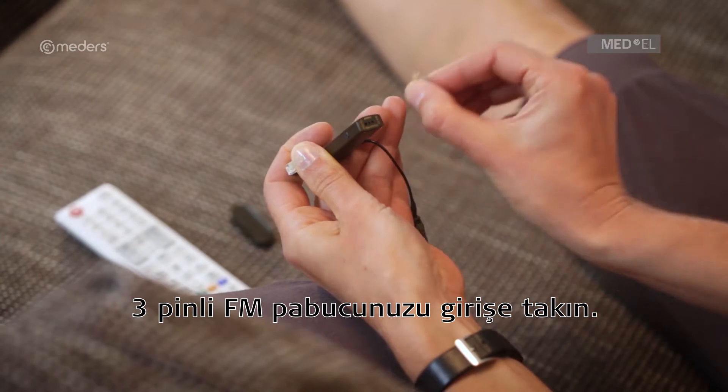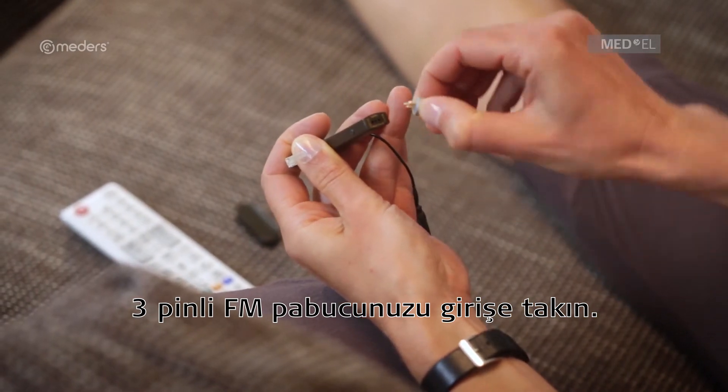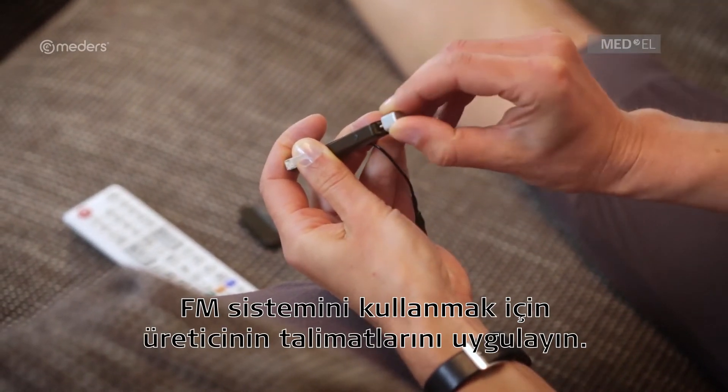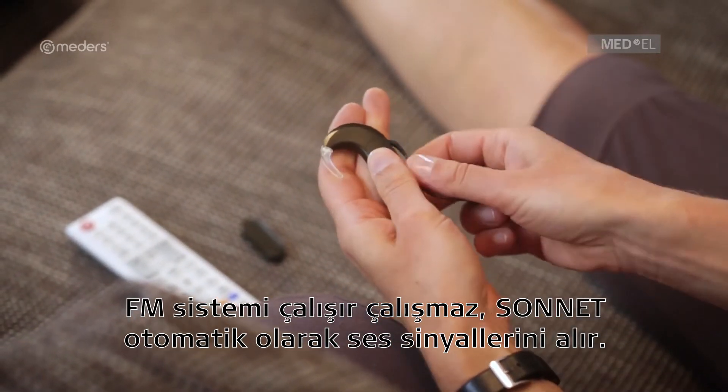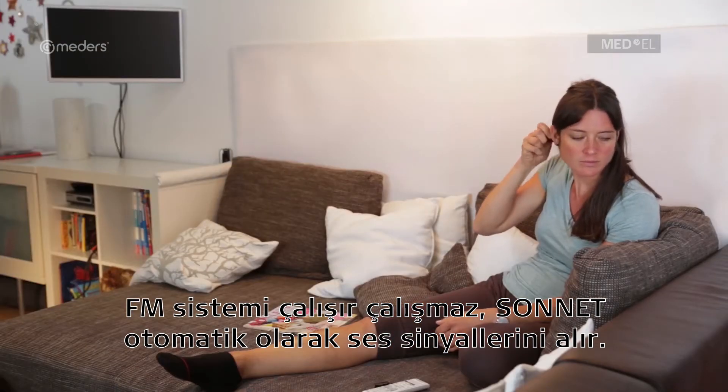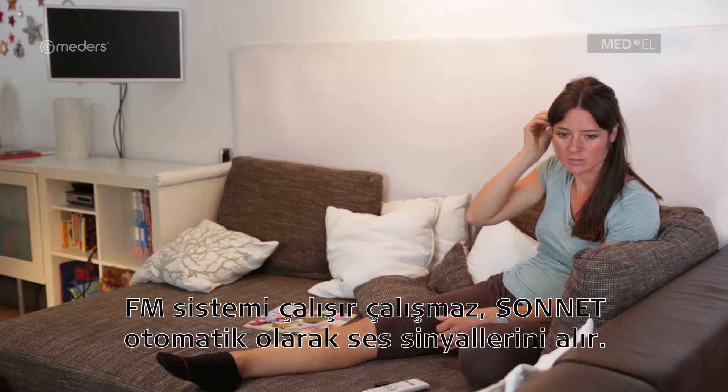Insert your 3-pin FM receiver into the FM port. Follow the manufacturer's instructions to operate the FM system. Sonnet will automatically detect sound signals as soon as the FM system is activated.